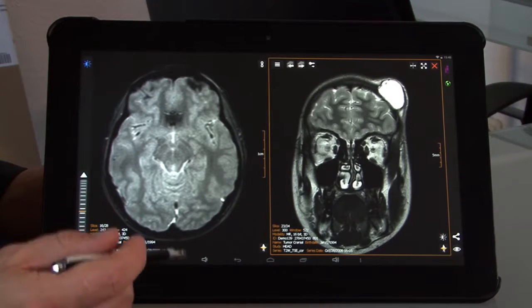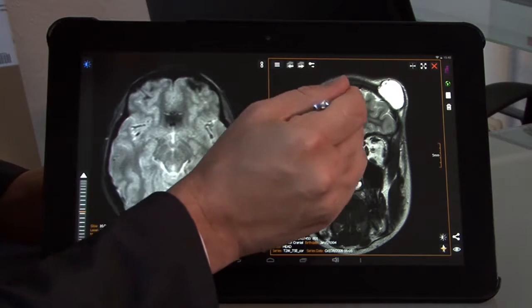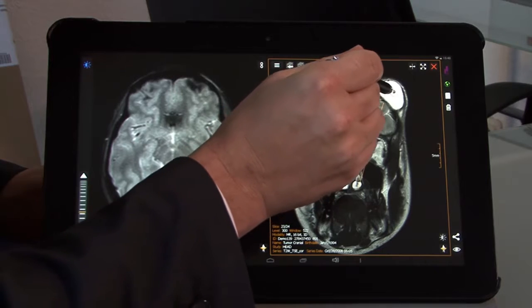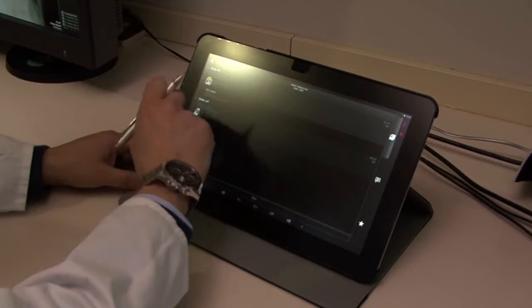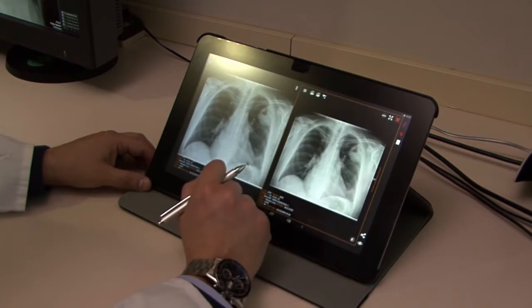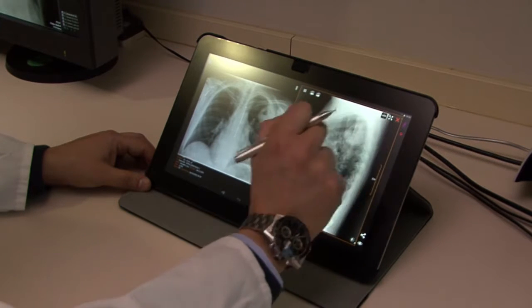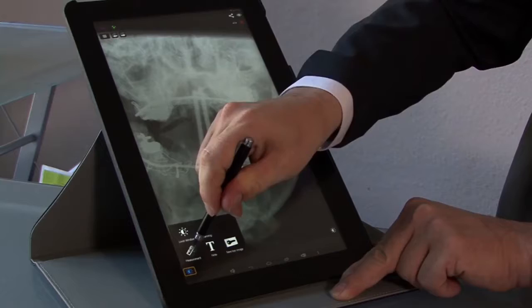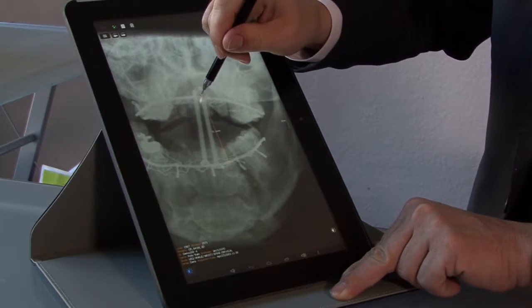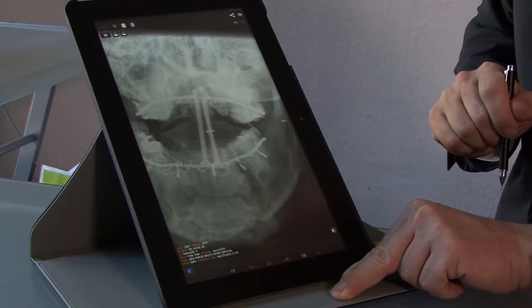MedTab can be operated in two different modes: in a color mode, which is optimized for color visualization, and a DICOM mode, which is optimized for grayscale images. The MedTab can almost be used anywhere where you have sufficient ambient light conditions. But it's really challenging for the human eye to determine whether the ambient light is okay or too bright. That's why we've built an ambient light sensor, which gives like a traffic light to visualize whether the ambient light is okay, limited or not acceptable for any image visualization.